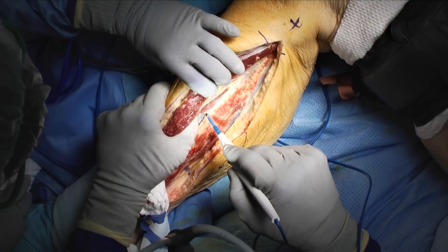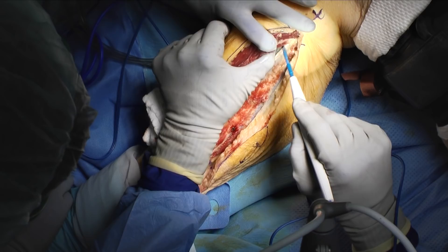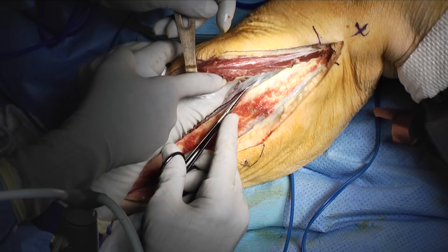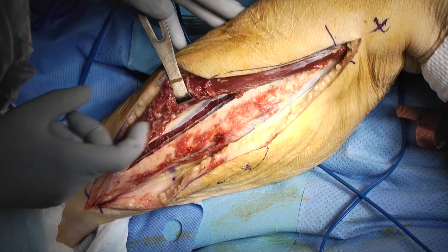After coming across the anterior portion of the fibula, dissection continues through the anterior compartment, elevating the muscle, elevating the anterior tibial artery and vein, and identifying the interosseous membrane between the fibula and the tibia. The interosseous membrane is then incised the entire length, all the way up to the proximal bone cut and down to the distal bone cut. This should be performed several millimeters away from the fibula to protect against inadvertent injury to the peroneal vessels, which lie deep to the muscle there.